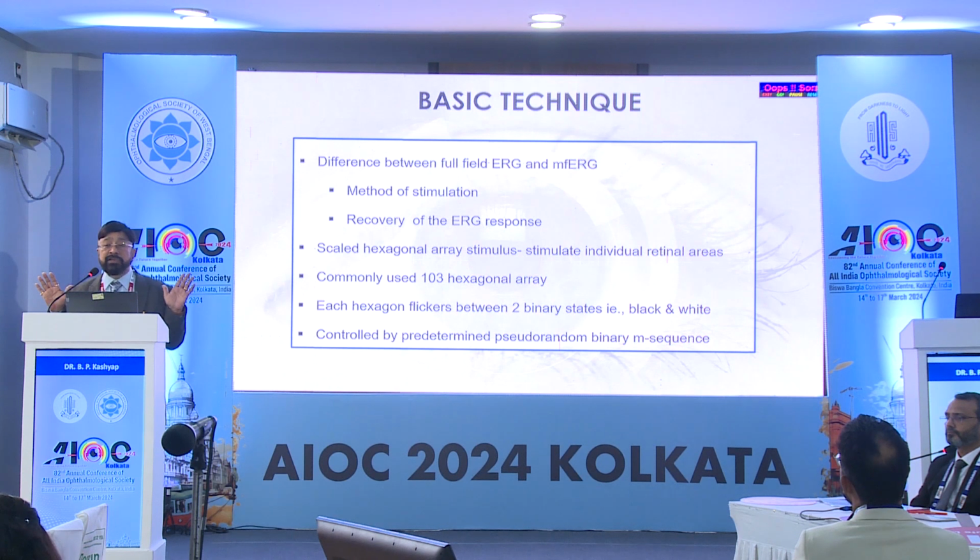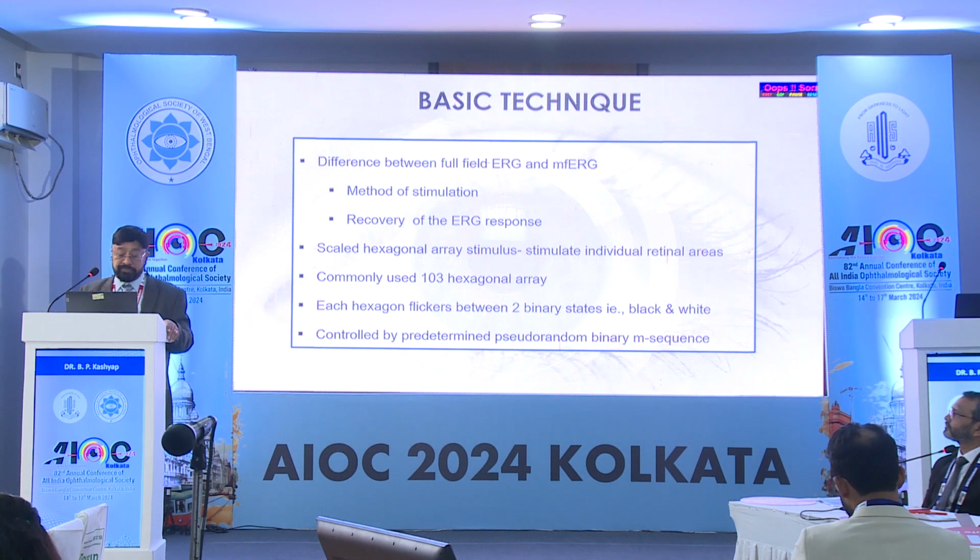So what is the difference between the full field ERG and multifocal ERG? In full field ERG, you have a bowl, and the flash of light comes from the bowl. In multifocal ERG, there is a screen with a checkerboard that keeps on flickering. In full field ERG you see the waves, but in multifocal ERG you get a topographic representation.